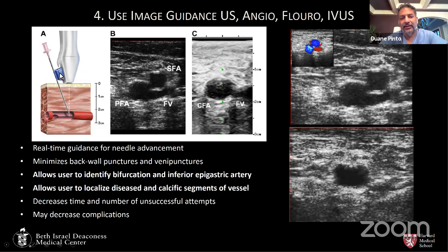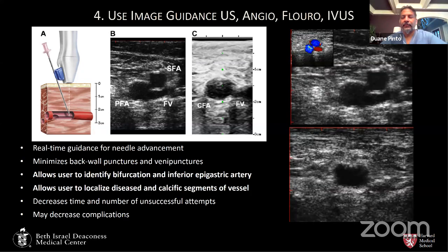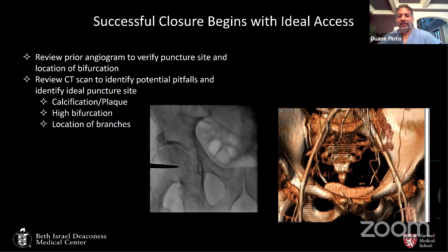You also can see that there's an ultrasound needle guide in this case, which allows you to have the correct angle of attack so that you're accessing the artery right where you've put your ultrasound probe. There are new ultrasounds in development that have both the cross-section as well as the longitudinal view in one image so that you can look in both views at the same time. Okay, here are the steps of ultrasound access.